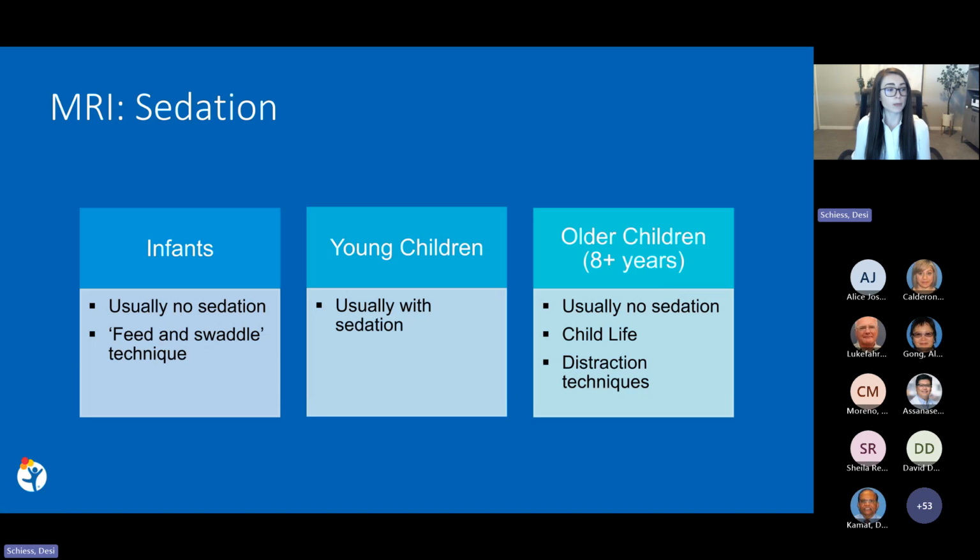Rapid MRI is an approach that limits scan times sufficiently to avoid sedation. This is often used for brain imaging, musculoskeletal infections, and even acute abdominal pain at some children's hospitals.